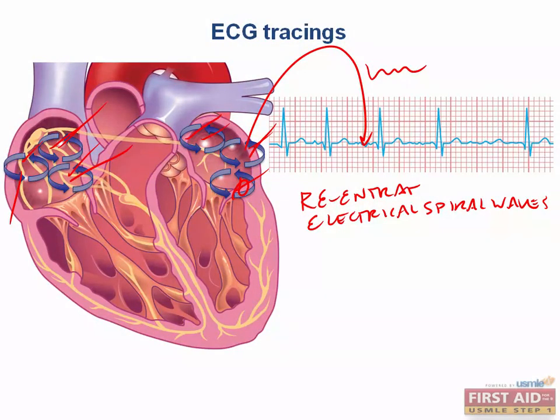So why are the QRS complexes spaced unevenly? Well, the SA node up here is not setting the intrinsic rate because there's so many random depolarizations everywhere in these atria. All of these different abnormal circuits can have different refractory periods, so you can have a random depolarization of the atrioventricular node. The AV node does not discriminate on which signal activates it. If a depolarization hits it, it's like, appreciate it, I'm going to go ahead and propagate this into the ventricles after my delay. It is basically just a first come, first served basis when the AV node has repolarized from the last time it was activated.